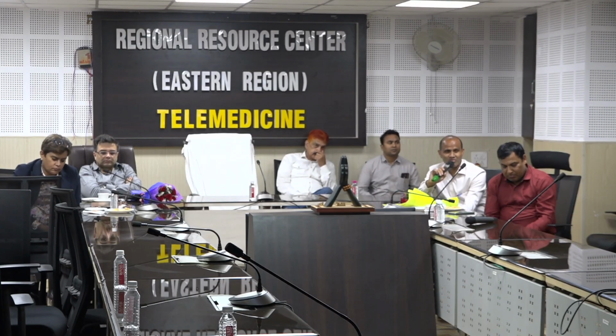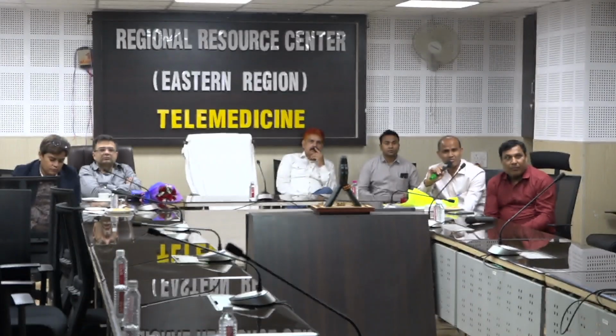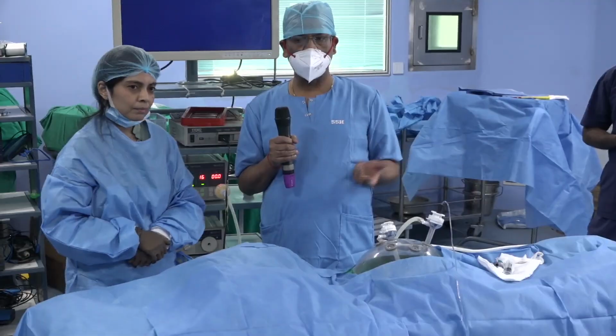There is cytotoxicity, and there is a lot of literature on it. Cytotoxic drugs cause many problems in the body. Particularly in women, there can be infertility and a history of abortion, and other drug toxicity, even allergy. Some people are allergic, with reactions of the skin and mucous membrane. So you have to avoid that. That's why the balloon trocar is to be used. You have to protect yourself. Because it is under pressure and there is aerosol, that is the more dangerous thing. If you stay there, directly or indirectly, you will be exposed. So you have to avoid that.